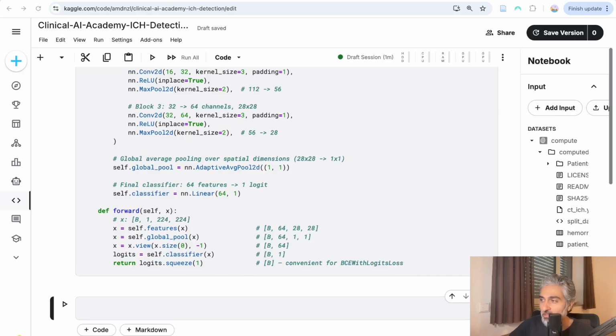And now it's time to introduce ResNet. ResNet is short for residual neural networks, which was introduced by He et al. in the paper Deep Residual Learning for Image Recognition.